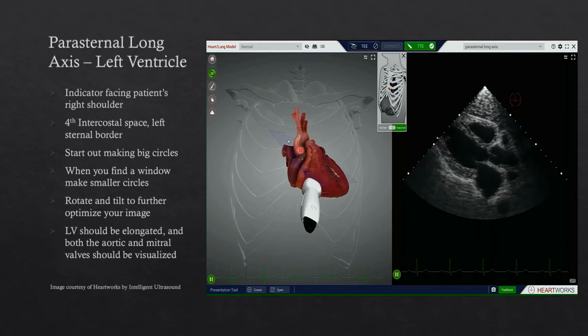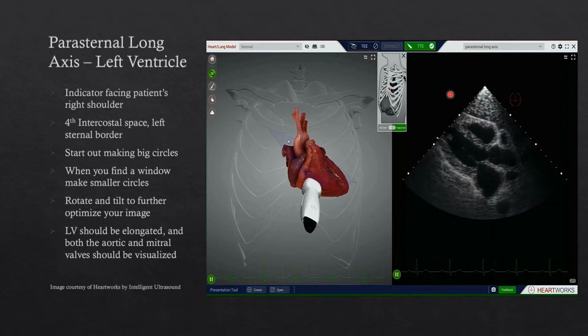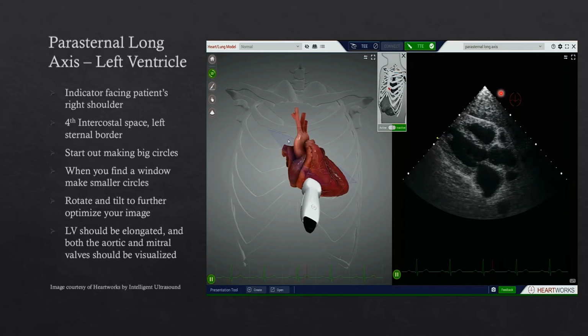We refer to this area as the base of the heart, the top portion of the heart. And we refer down here, this bottom portion, as the apex of the heart. So base, apex. Now, this is as the heart's sitting in the chest. What we're seeing up here is what we see on our ultrasound machine screen. So I want you to think of our ultrasound transducer sitting up here looking this way at the heart. So this would be considered the near field of our ultrasound beam. This would be considered the far field.